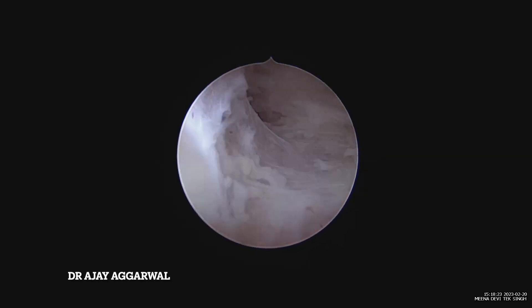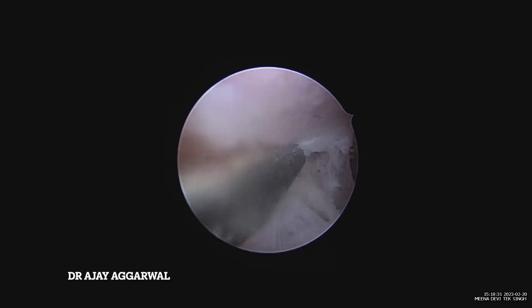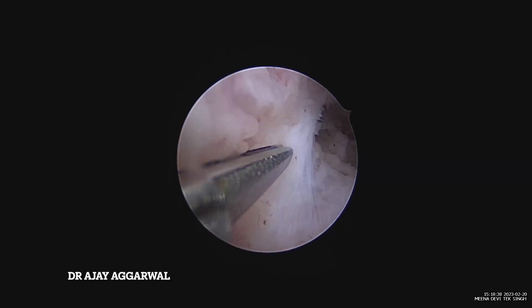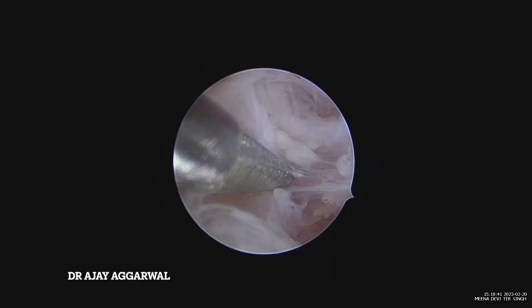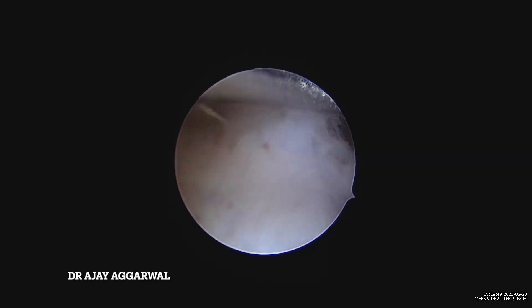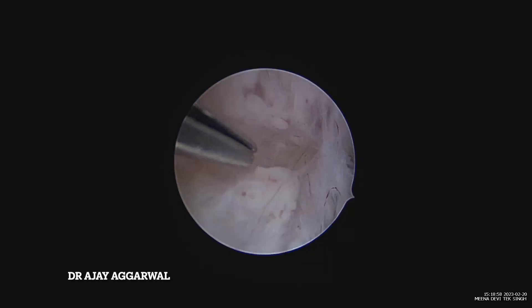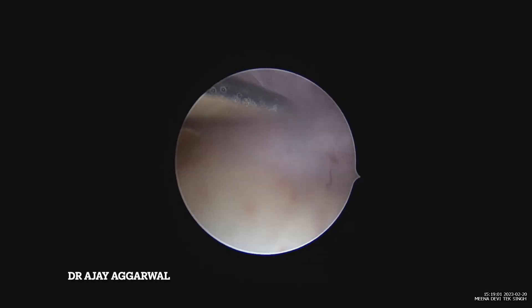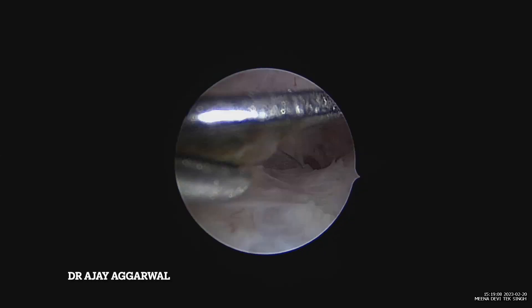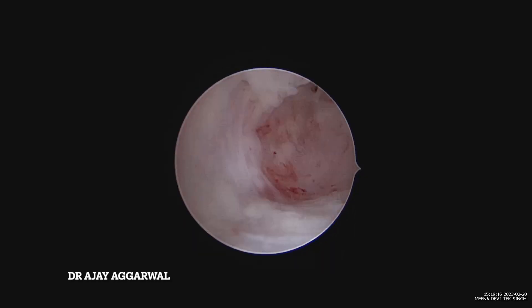Here there are small adhesion bands which are cut now. My light cable of the scope goes towards the right side and my scissor comes from the left side, so I am holding the scope with my right hand and the scissor with my left hand. Because I already opened up the cavity I know the boundaries. Here I cut right in the center and go again, staying along the lateral wall.